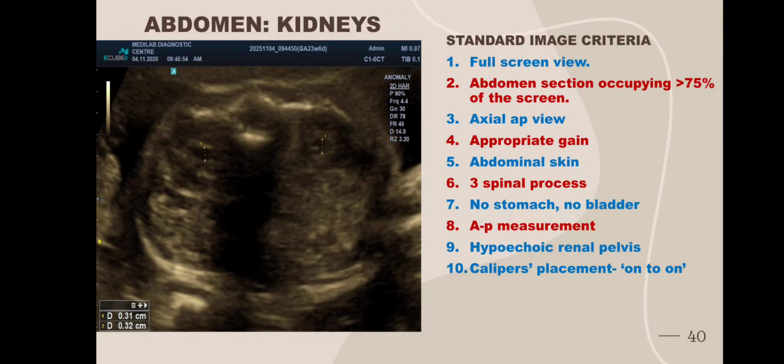Come to the kidneys. Abdominal views or kidney views. Assess both kidneys with proper magnification. Axial anterior-posterior view with appropriate gain.